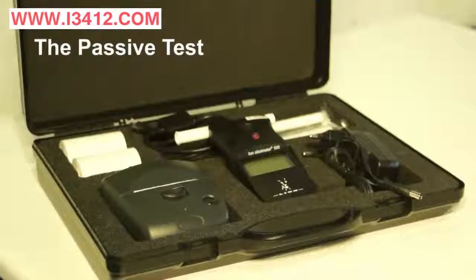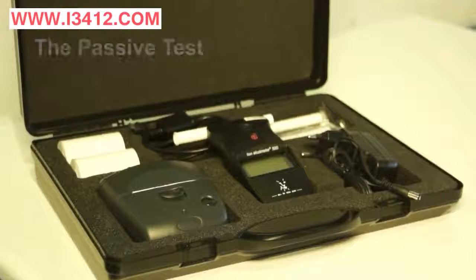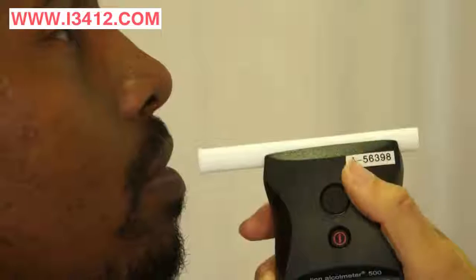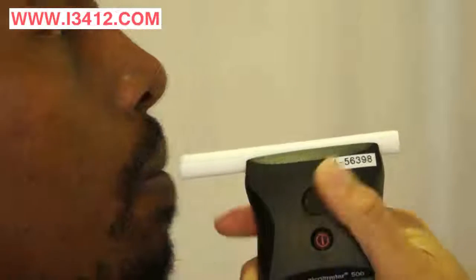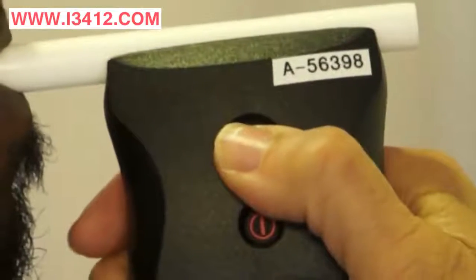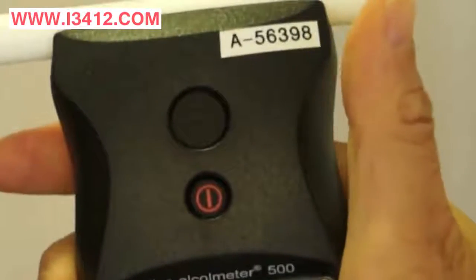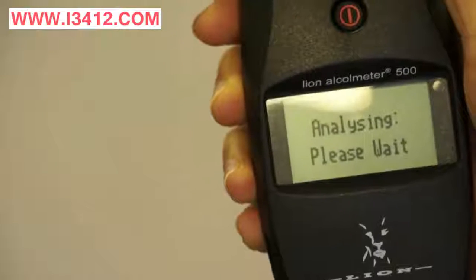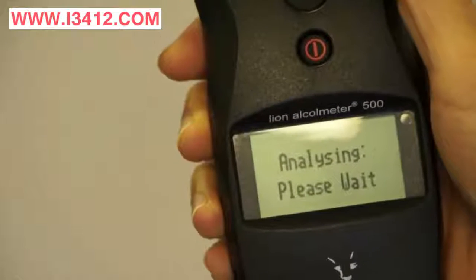For someone who is struggling to blow long enough or is not cooperative, the A500 has a passive function. For the passive function, instruct the individual to blow through the tube and then press the large button as soon as the subject starts to blow through the tube. This is extremely useful in ensuring that every person is capable of being tested.